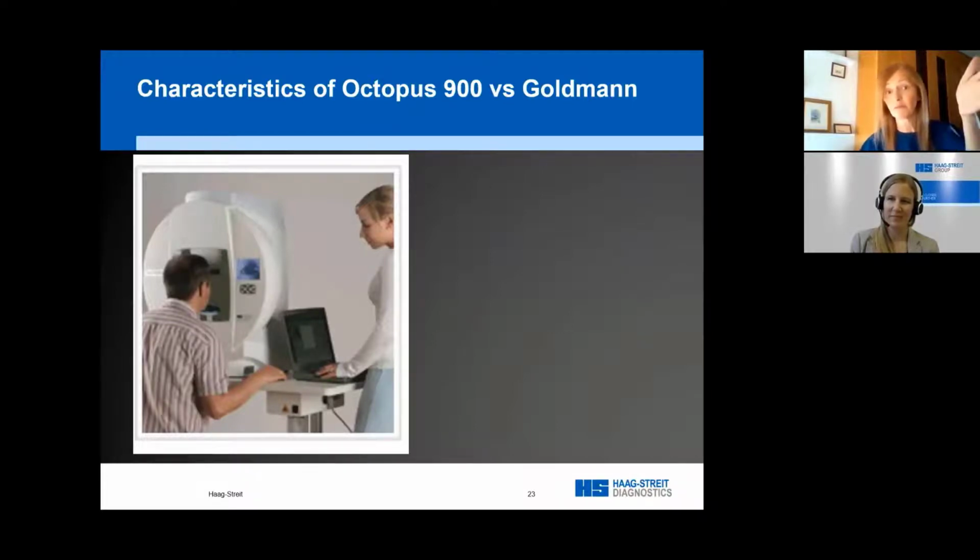I can put my hand at the back of their head to keep their head in position on the chin rest. Those of us who do field testing regularly know the patients who back off the chin rest or move their head. You can fix them in there if you need to, and that's much easier to do when you're side on as opposed to around the back.